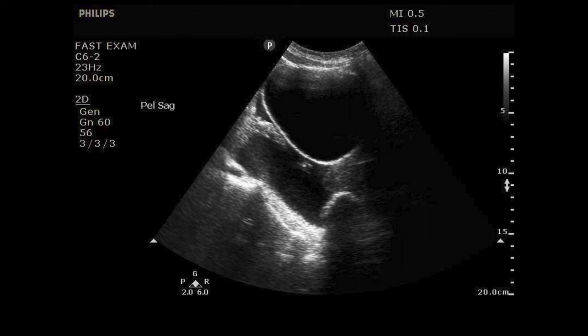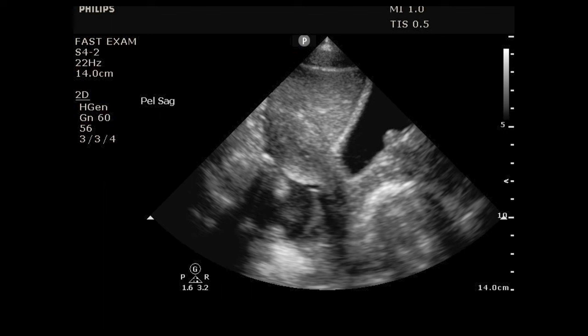One thing to be careful about: fluid that is blood can clot. Here's an example of clotted fluid that's easy to overlook. You see the bladder on the right — that anechoic rounded structure. Toward the left, halfway down the image, is a vague oval-shaped thing amid mid-gray echogenic material — that's the uterus. Right above it is a mid-gray, decently homogenous amorphous thing that's not supposed to be there — that's clot between the uterus and bladder. Be on the lookout for that.